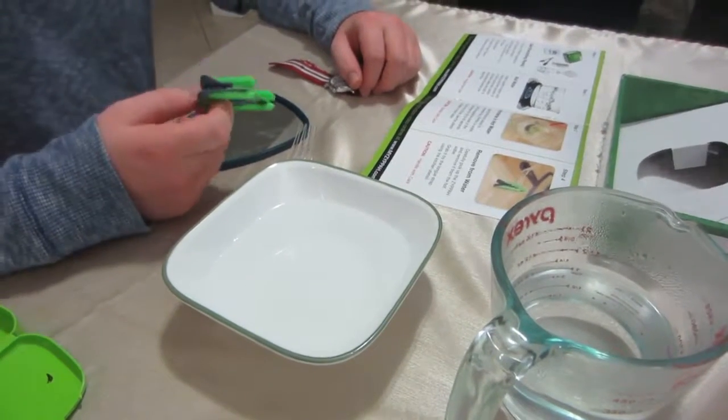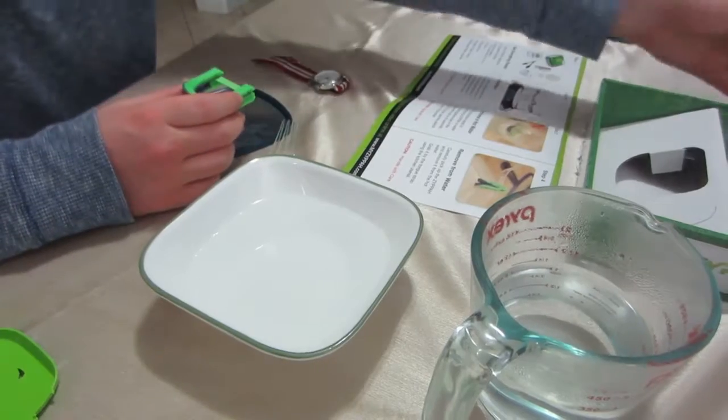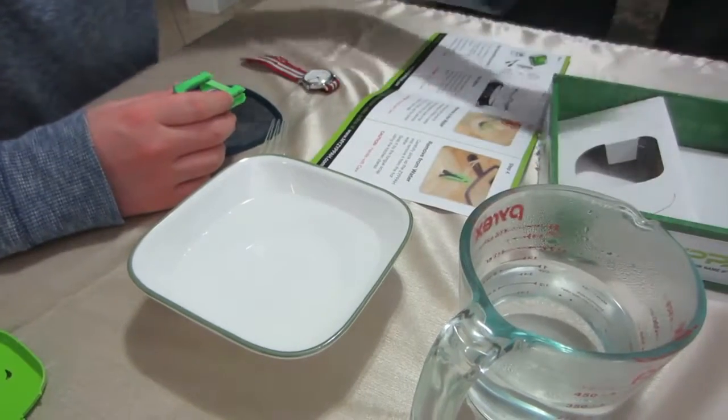I have my Zippa anti-snoring device and I am going to mold it now. We just opened it up and took it out of the box. We have the instructions here.